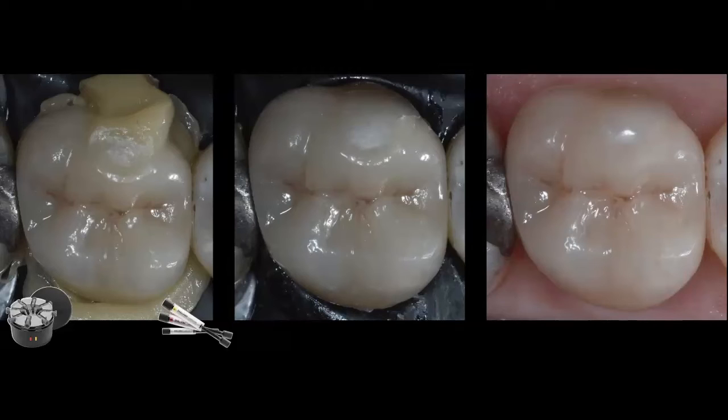I leave it there maybe around 3 to 5 minutes. So when I am ready to deliver the restoration, I'm literally injecting this composite, this micro nano hybrid composite, within that intaglio surface of the restoration. But because it was warmed, it was heated, it really comes out very nice and flowy out of the compule. And what you're seeing here is I am now seating my restoration, and this resin, this composite that is warmed, you can see how it really expresses itself out through the margins, sealing everything very nicely.